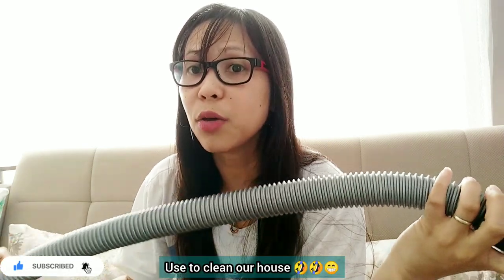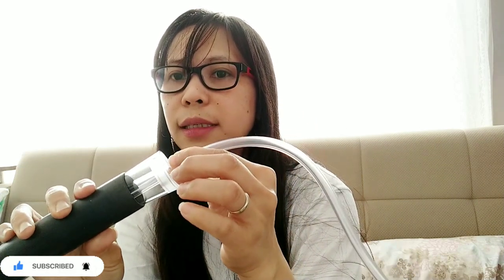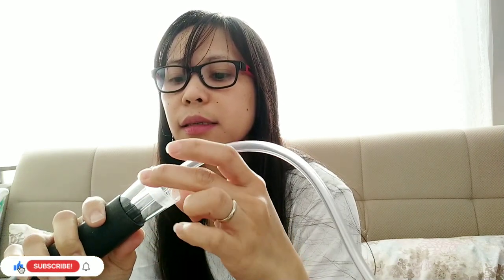Let's try these items, guys, to see if it works for my baby. So this is our vacuum cleaner that we use to vacuum our house. So we will try to put it and do it in my baby's nose. So this part, we're going to put here like this. After that, we will put these things like that. We will connect them and we will turn on the vacuum.